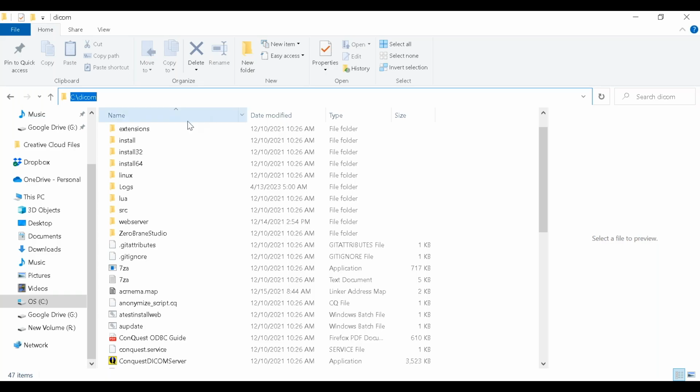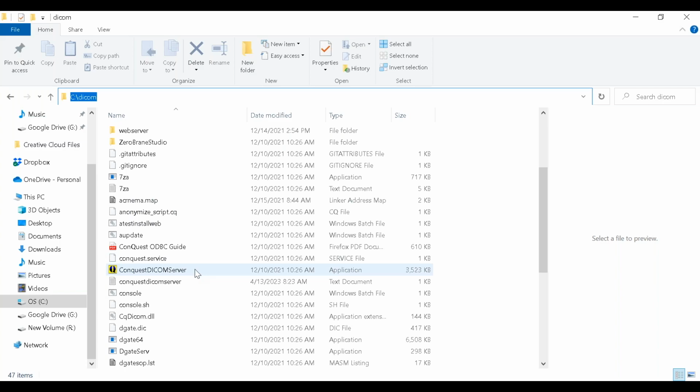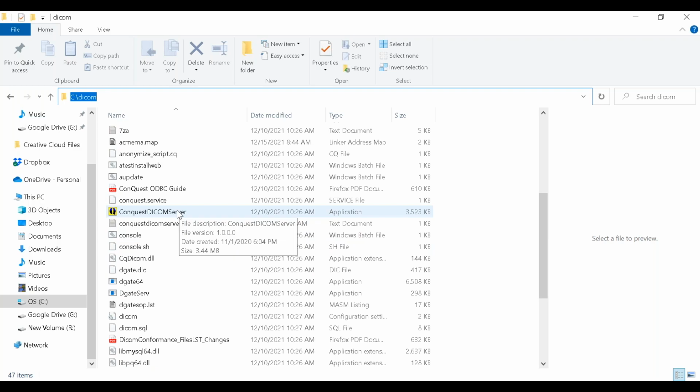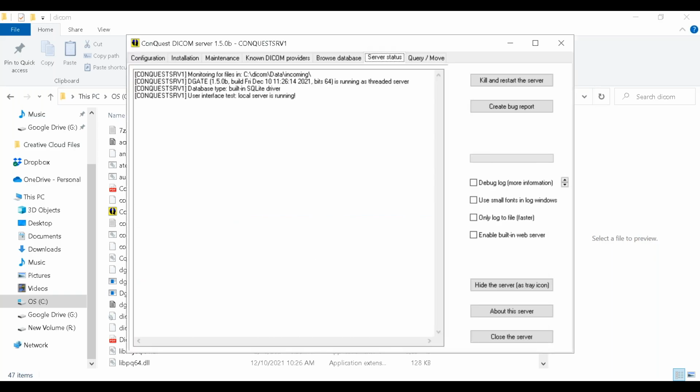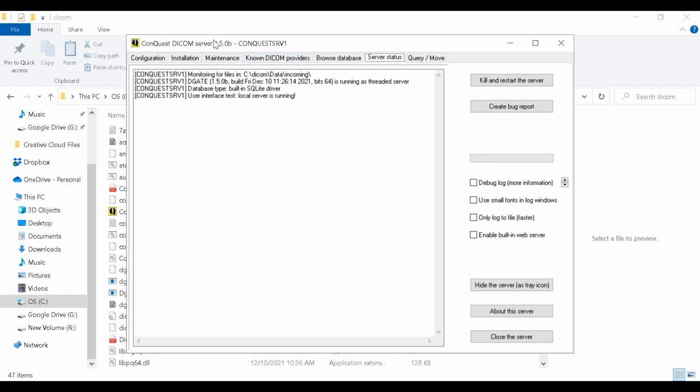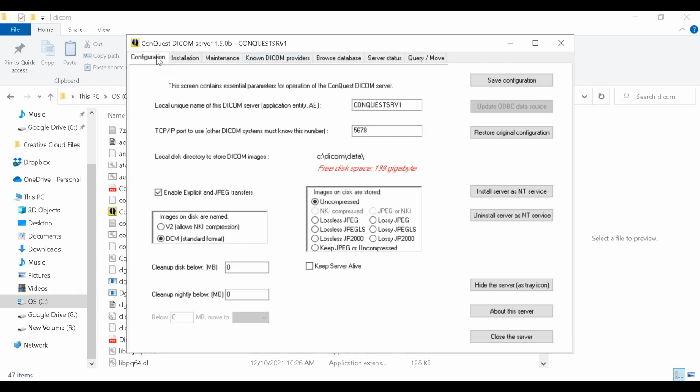So once you unpack and unzip this file, it's not gigantic, it's probably about 30 megs, it'll give you this thing right here, which is the DICOM server. You go ahead and click on that, and I've already got it up and running, and it'll take you to this, which is the actual server itself. Now, it might originally take you to the configuration file, and there's a lot of things here that you could be very concerned about, but one of the things I like to be concerned about is right here. Does everyone see that, where it says install server as an NT service? What that's doing is installing this so that it will start up with your machine.